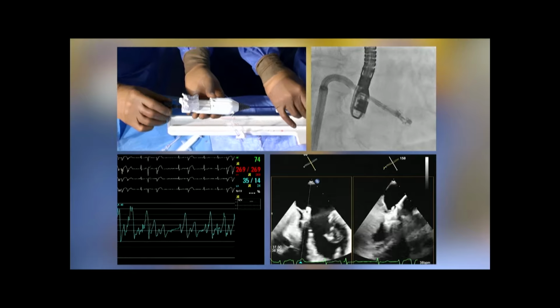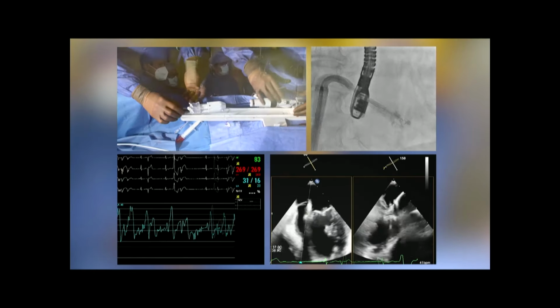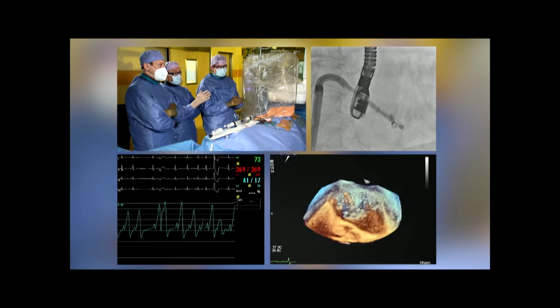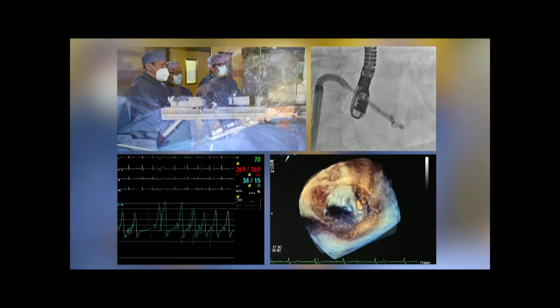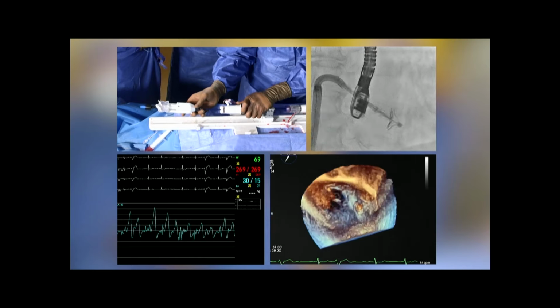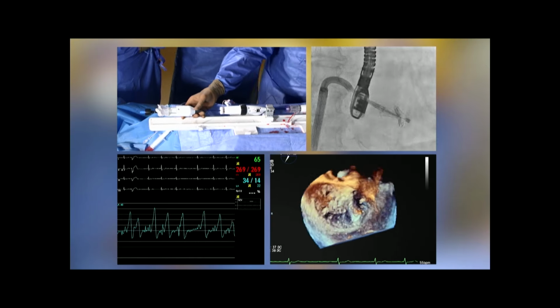Okay, so I'll try to be more medial now. 3D, please. We change the clocking. That will change the medial lateral position as well. Maybe we can even come a little bit more medial, huh? Yes, and then more medial if possible, but that's not easy. There is already a bit of tension on it.